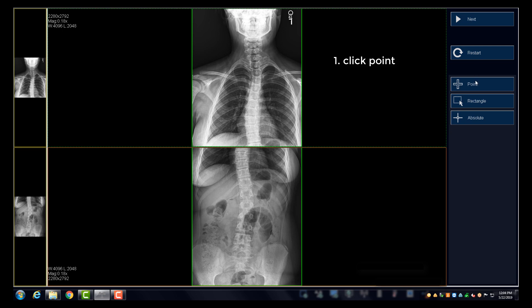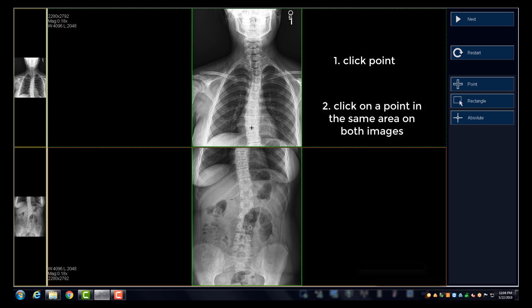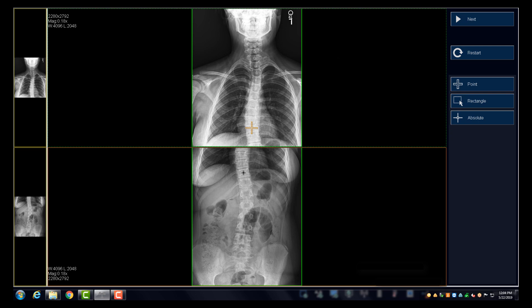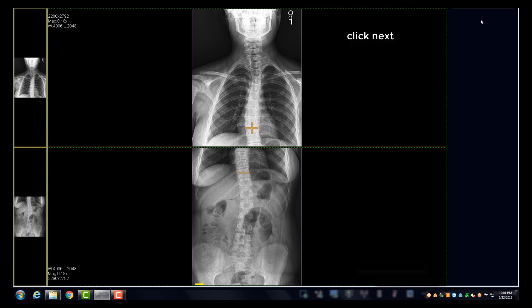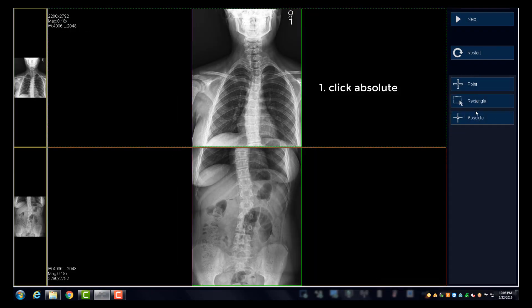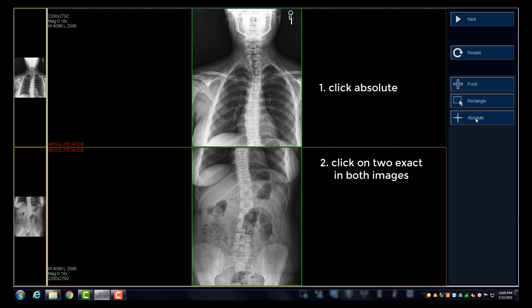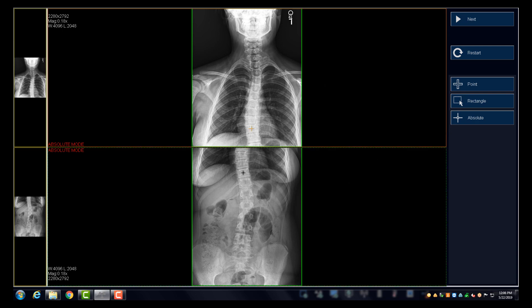For the next method, click two like points. Select the Point button, then select a point on the top image and a point on the bottom image in the same general area. Then click Next. With the Absolute method, click Absolute, find a point on the top image and click, and then click in that exact same point on the bottom image. Then click Next to stitch the images together.